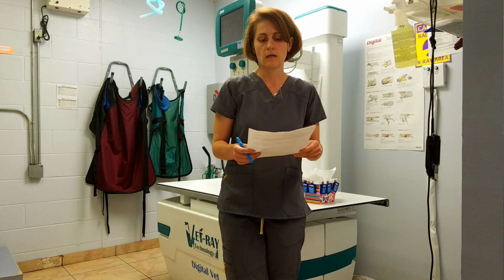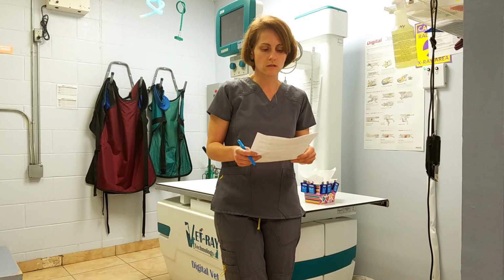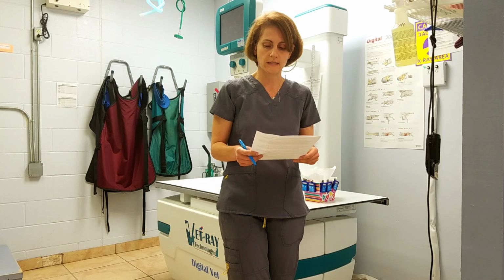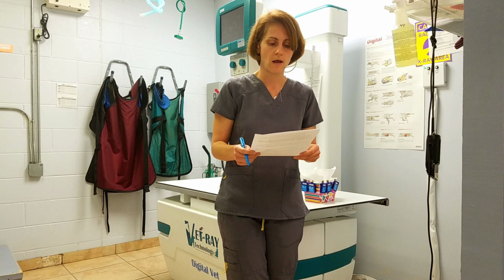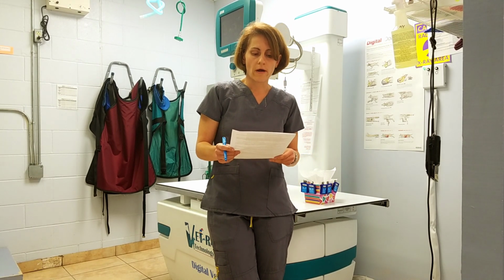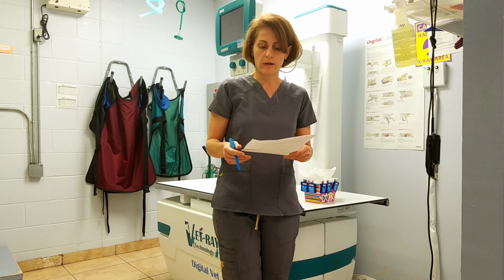At the end of this video, we'll show you where that is. The rules require that a radiation safety officer be designated. For Southside Place Animal Hospital, I am the radiation safety officer, so if you have any questions or concerns, just let me know. So the first section, if you're following along on your handout, this is A, operator safety.